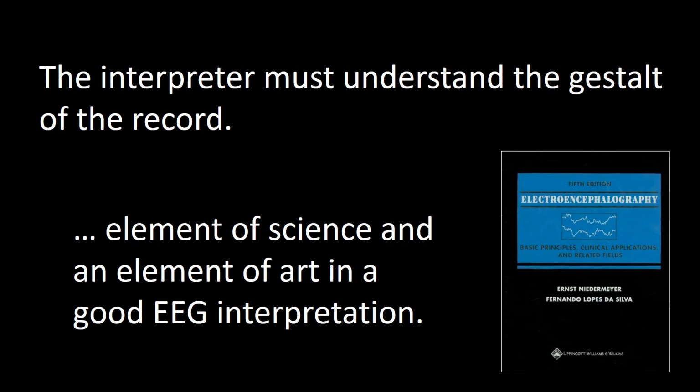Few single findings render an EEG abnormal, and many questionable activities are better considered normal unless they fit with the clinical findings. When uncertain about an EEG, ask, repeat the study after sleep deprivation, or do a longer EEG. But whatever you do, do not establish abnormality without there being one.